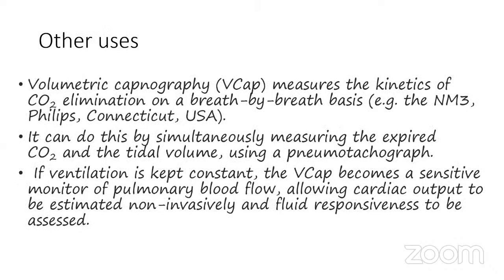The other use is volumetric capnography, that is VCAP, which measures the kinetics of carbon dioxide elimination on a breath-by-breath basis. It can also be used simultaneously with tidal volume and the pneumotachograph. And at the same time, the latest ventilators have indirect calorimetry, where the oxygen consumption and the carbon dioxide produced can be used to calculate the nutrition requirement of a particular patient.